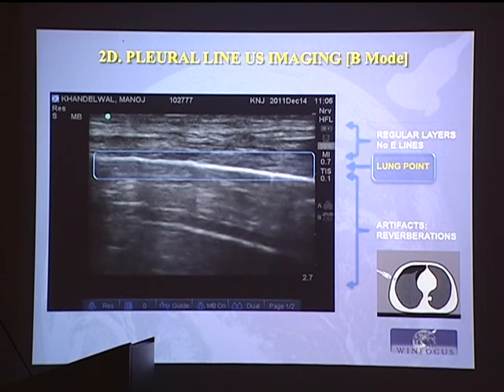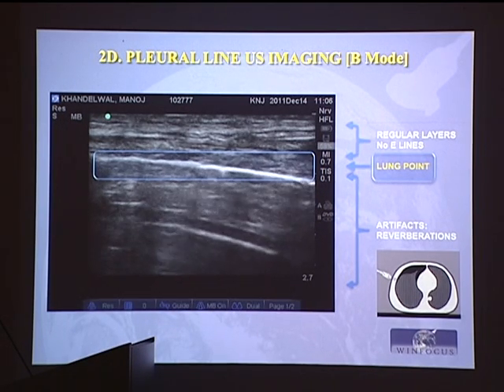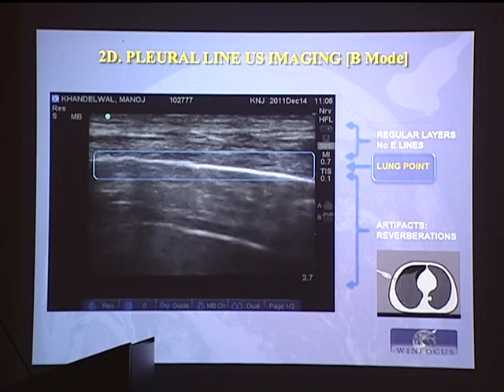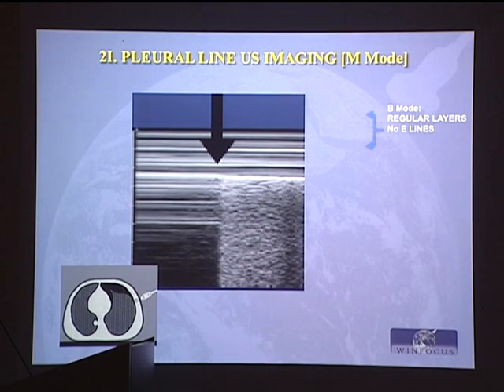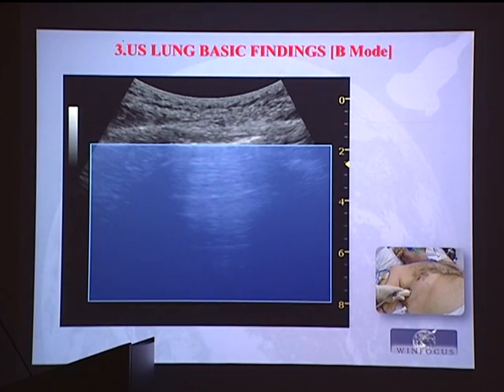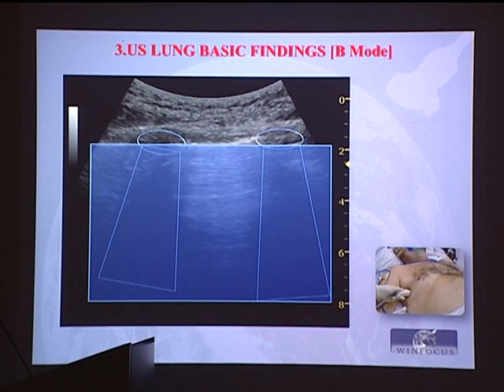So we could presume the extension of pneumothorax looking at this kind of artifactual appearance of what we call the lung point.